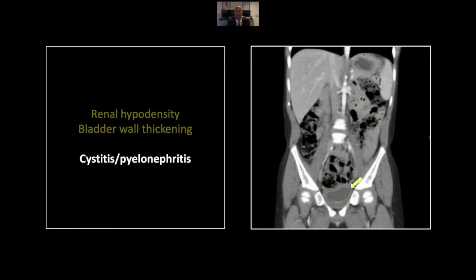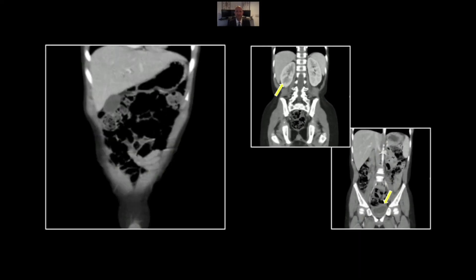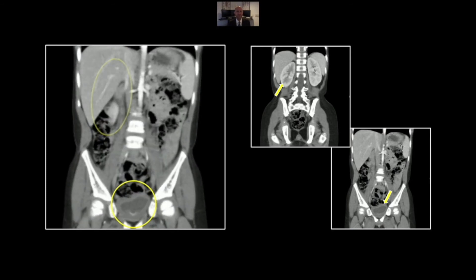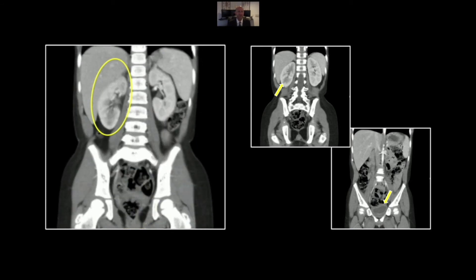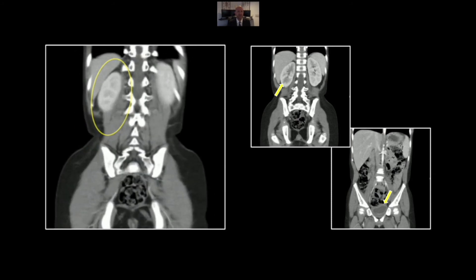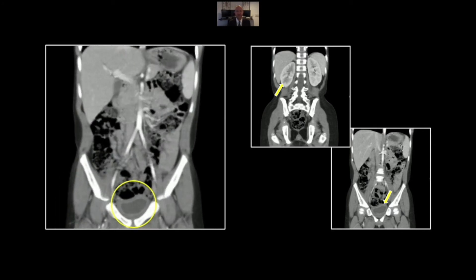Here it is on the coronal, the thick-walled bladder. And here, both inferiorly and superiorly, those regions of striated hypodensity in the right kidney. There is the cystitis here. Those striated hypodensities, pretty subtle, but consistent with multifocal pyelonephritis.